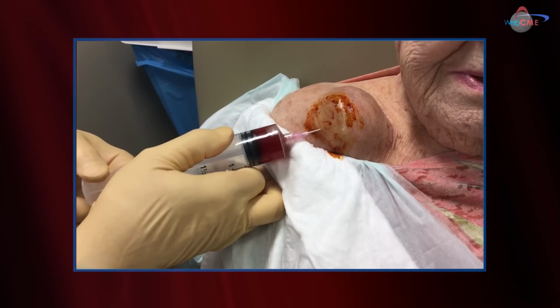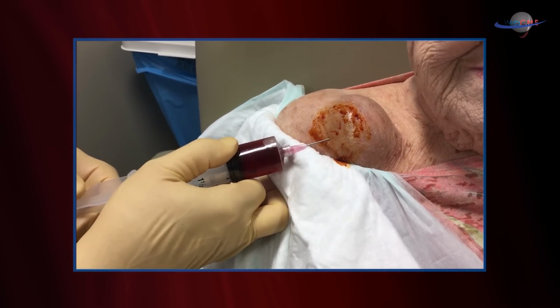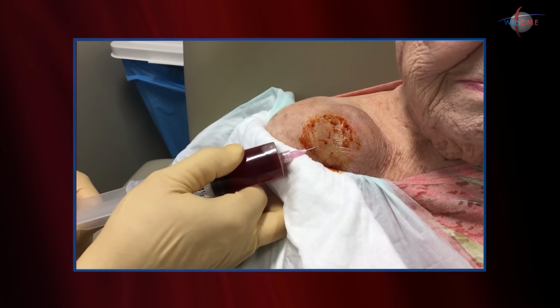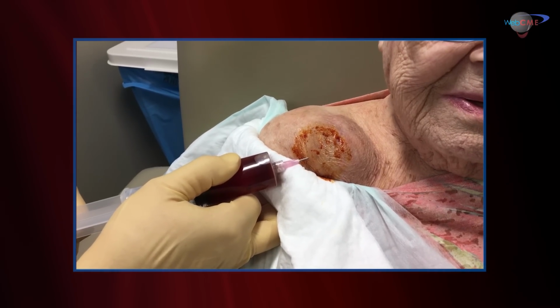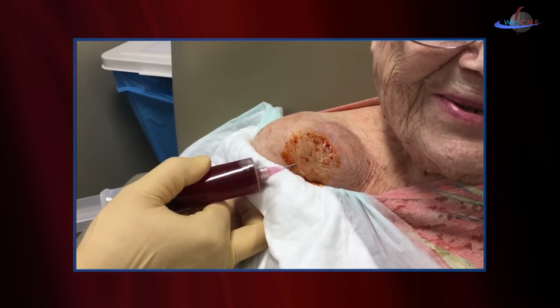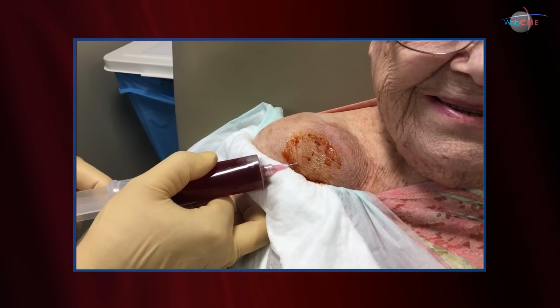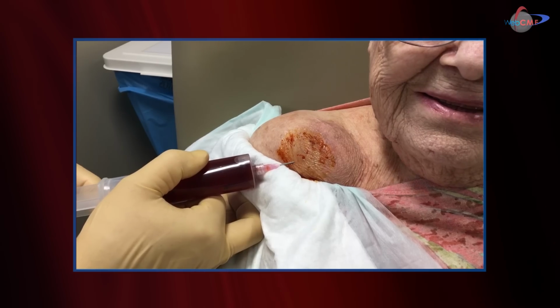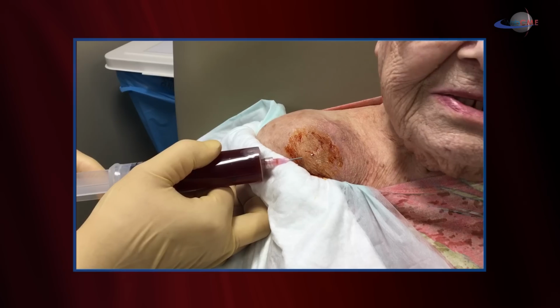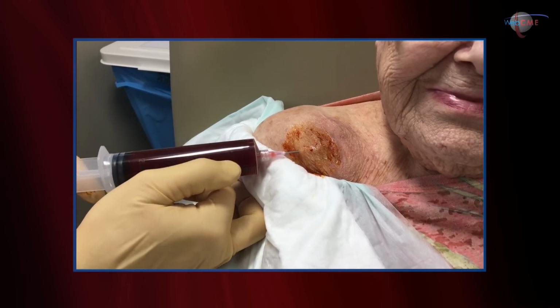It's actually fairly thick. The fluid is fairly thick, and you can see it is sort of sanguinous in nature. You can see it decompressing there. So we're going to make that cyst do the Houdini act and disappear for you. That's very soft now. I'll try to drain as much as we can. A lot of times these things are loculated on the inside, so I'm moving my needle around just a little bit. Try to stay inside that space. It doesn't hurt.